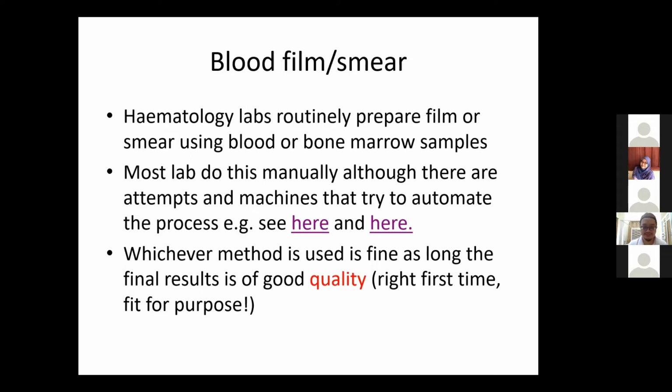Perhaps it's good because we don't have to always spend money for something which is still new and still has a lot of limitations. And like I said, at the moment, the way I look at these machines, they are still quite slow to operate. It's much better to do it manually at the moment.